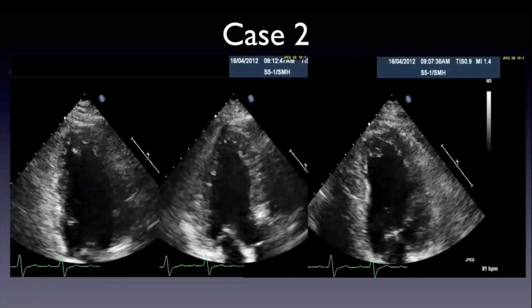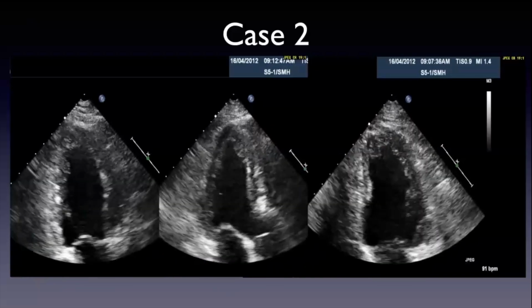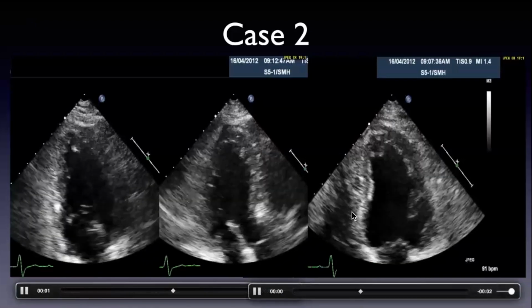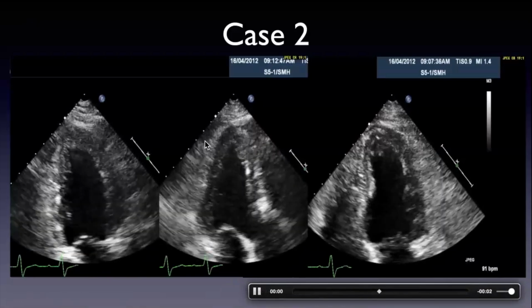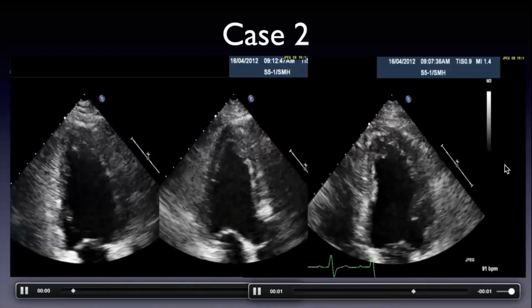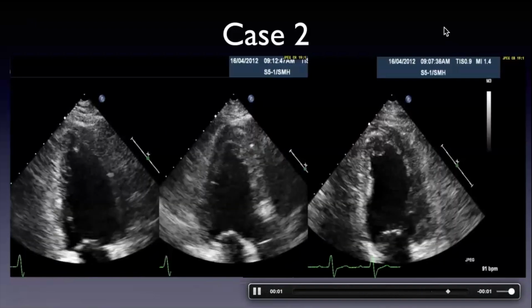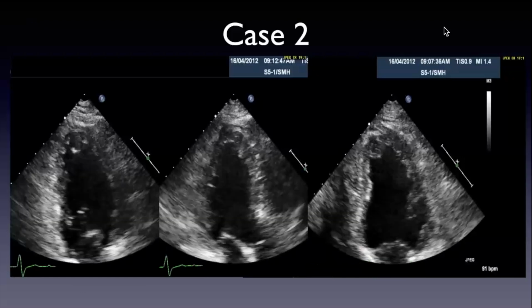Yeah, no, I agree. Actually, it's probably the classic global with regional variability. You can see the inferior wall is probably more affected in the 2-chamber view, maybe the inferolateral, maybe the inferoseptum. We know the patient has coronary disease, etc. And as you said, there's this echogenic structure at the apex, and it's an area where the wall is not contracting fully normally as well. So the question is, is this an LV thrombus? It's actually more prominent in the 4-chamber view. Exactly. And I think there was an initial thought that this was a thrombus, actually.